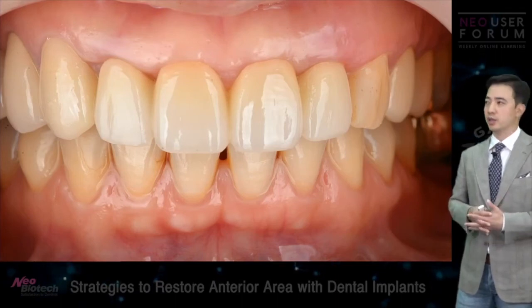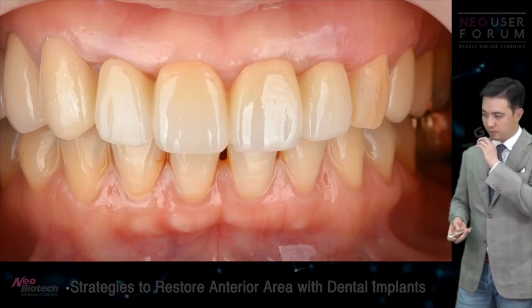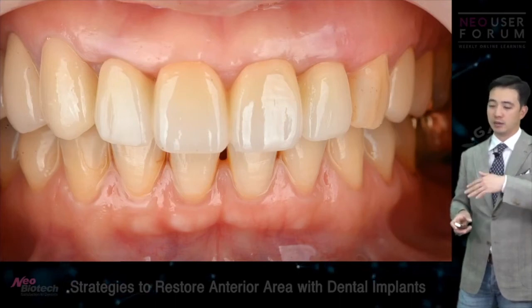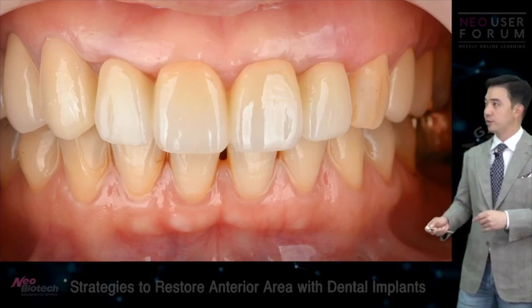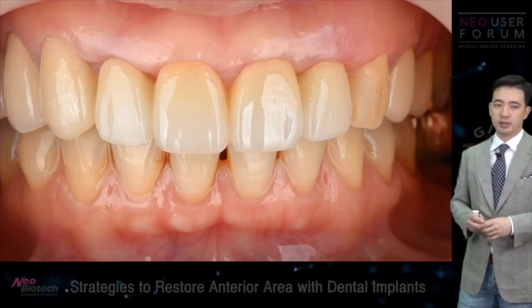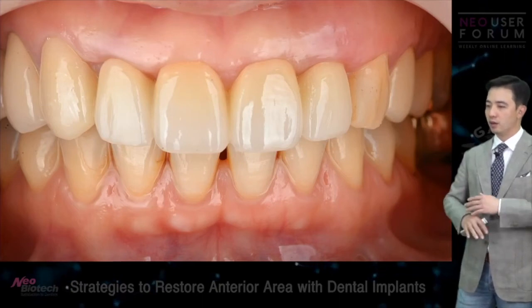resorption. I didn't really describe it for this case, but what I did was kind of an envelope flap, through and through the sulcus, and I think that's enough to treat these kinds of cases rather than opening a whole flap.